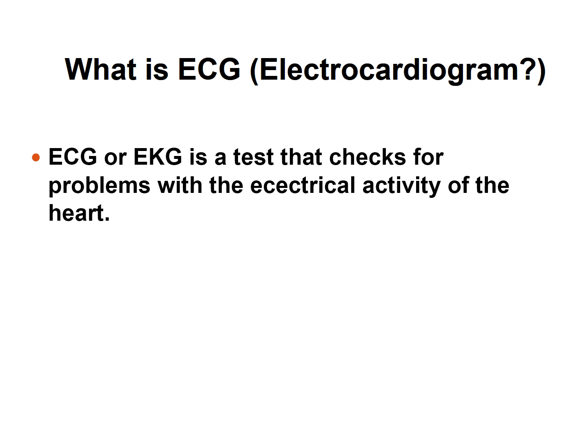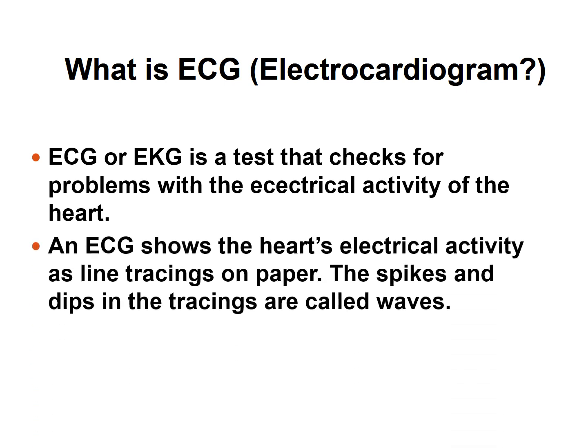However, we want to evaluate the heart function. But make a note: electric activity is not equal to the mechanical function of the heart. An ECG shows the heart's electrical activity as line tracings on paper. The spikes and dips in the tracings are called waves.